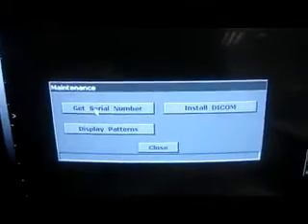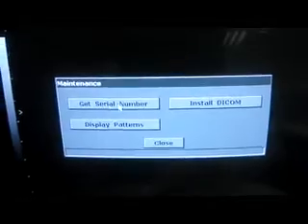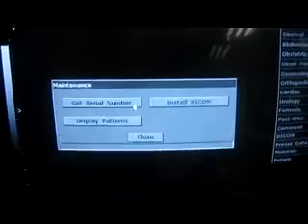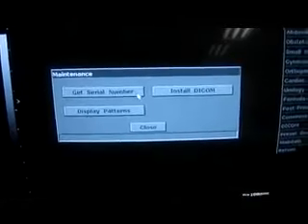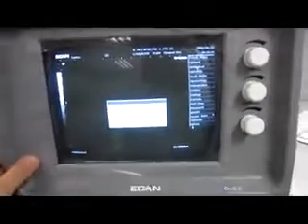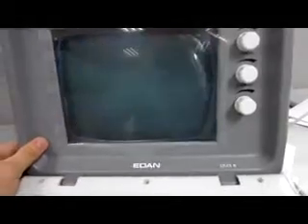Click Install DICOM here, put the activation code, and DICOM will be activated. After it is activated, we reboot the machine. On this machine I have already activated the DICOM.